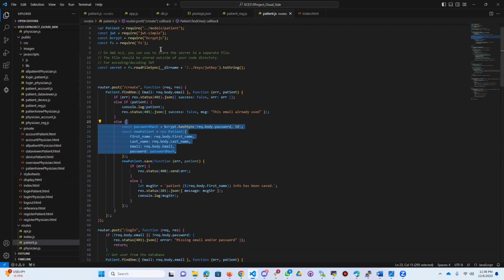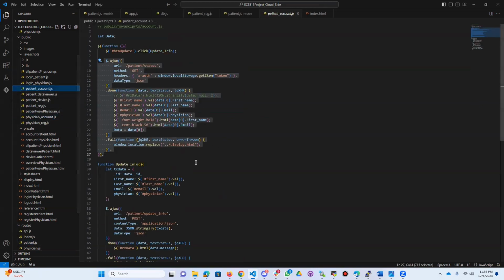I guess I have opened it or not. Okay, let me open it. It is the patient account here. Here, in the patient account, you can see that the code also uses an AJAX request, and the server endpoint is patient/status, and this is a GET request. The last one was POST, this one is GET. So that's why I'm explaining this one to retrieve patient information from the server. The last one was to upload data. This one is to get data from here. The things are the same, but the requests are different.